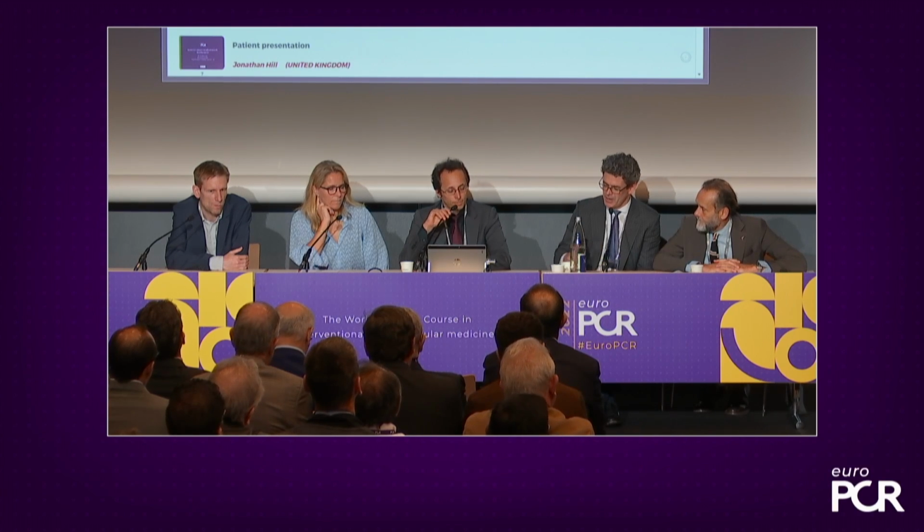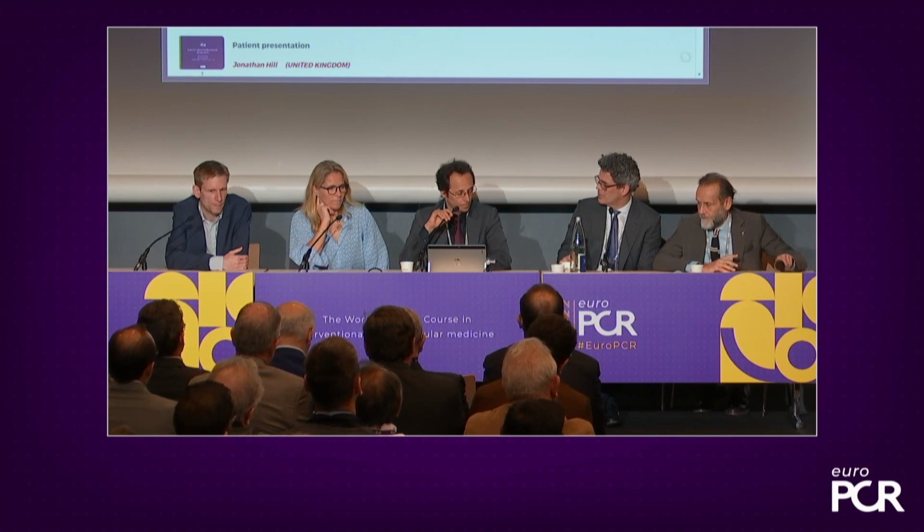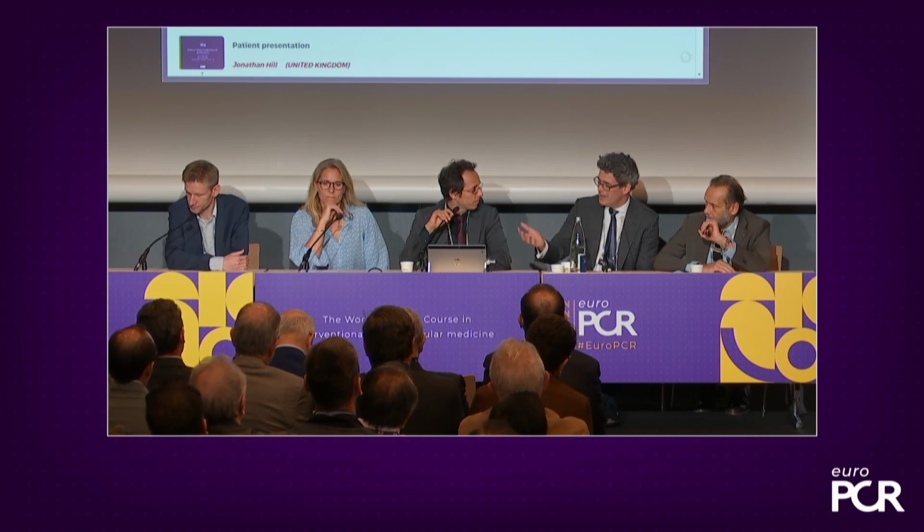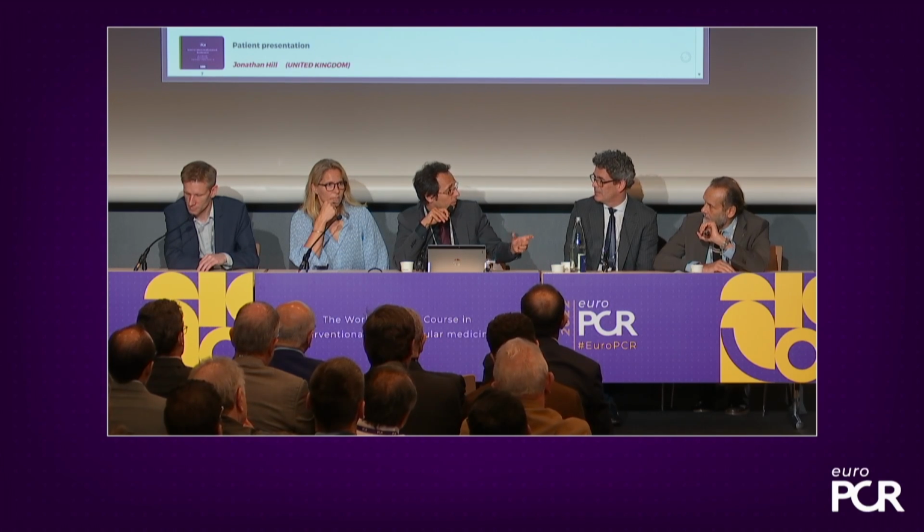You can always deflate the balloon after a few shocks and then deliver them 5 at a time rather than 10 at a time. I think it's very safe, and I think the timing can be very short, where you can deliver a sufficient number of shocks, and you can let the vessel breathe, reinflate, more shocks, and just go through that cycle. Yeah, so probably let a little bit more time in between the inflations, right? That's probably the key message. But that's just normal left main practice, isn't it?